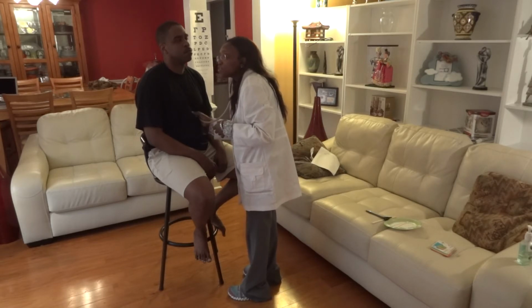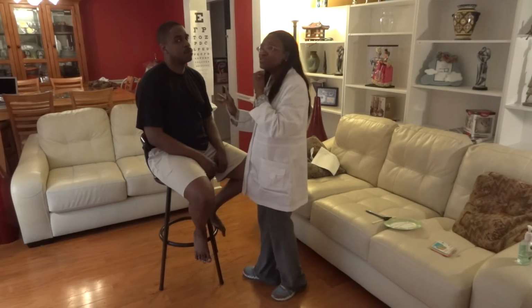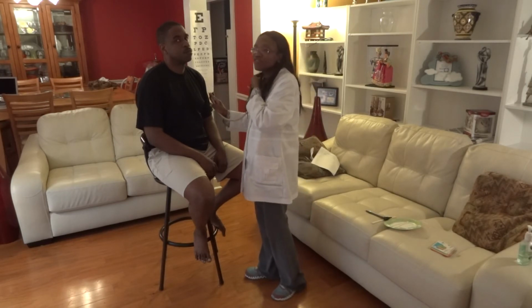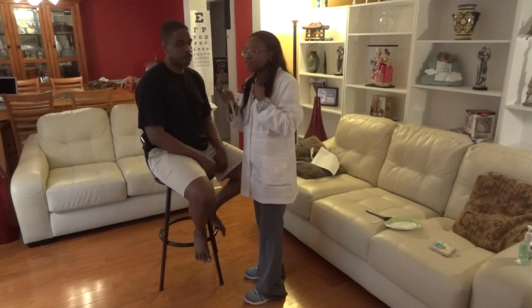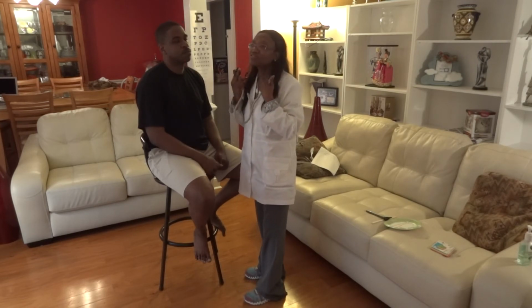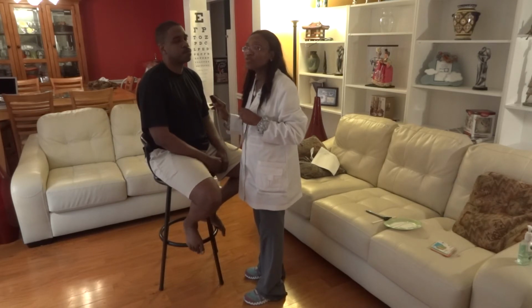Okay, auscultating the heart, I started at the right second intercostal space, and then I moved left to the sternal border, and I auscultated down from the 2nd to the 5th intercostal space and also to the apex. So now I'm going to do the same thing with the bell of my stethoscope, and S1 and S2 were heard, which were normal heart sounds.